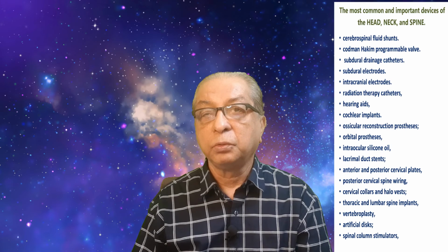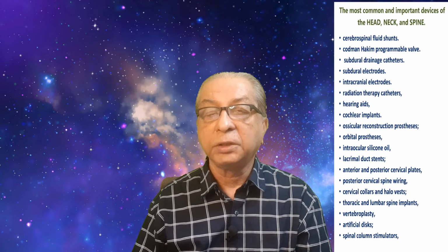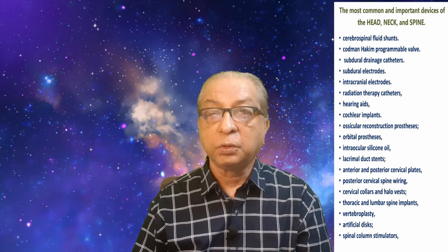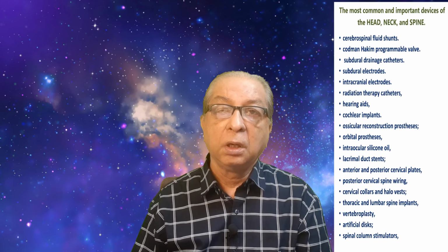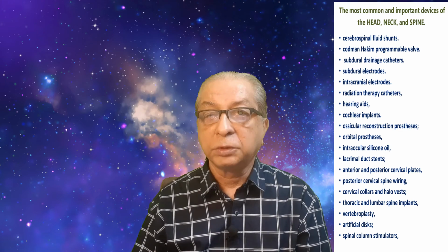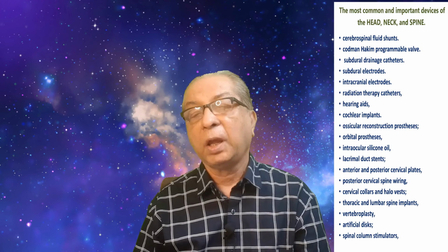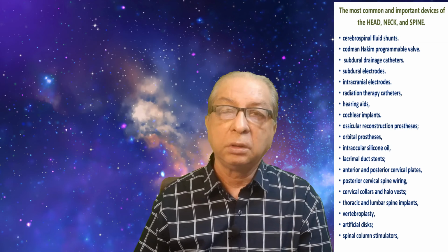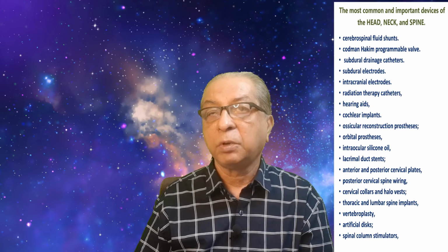And if you use this cervical collar and follow the instructions for cervical exercises, it really helps you to get out of the imbalance and what is called a spinning feeling of the head. And these are the very common devices that are used in the neck region.